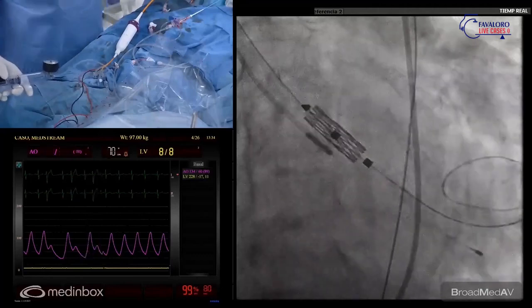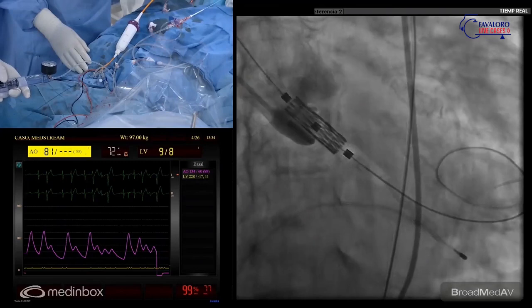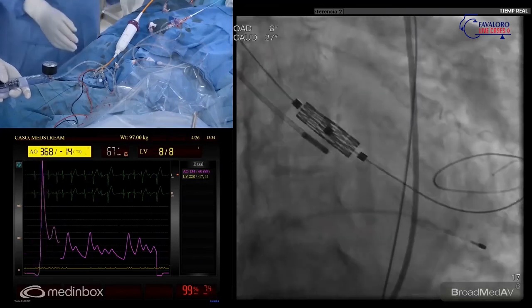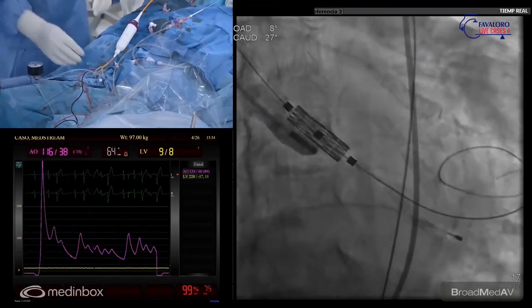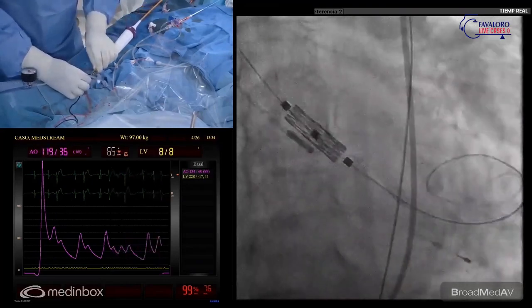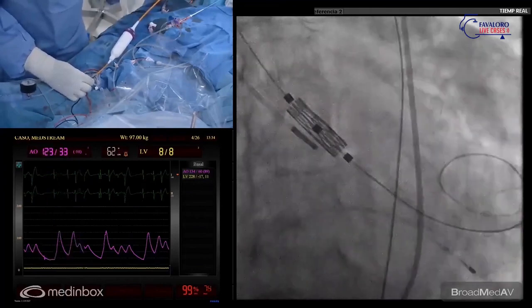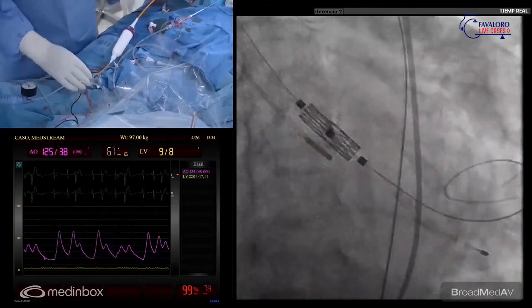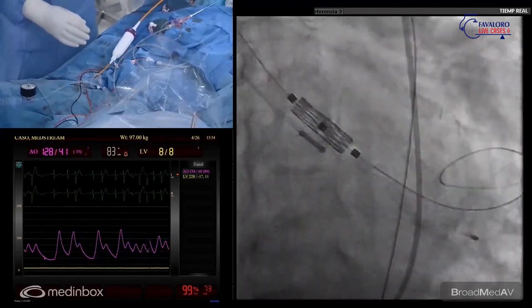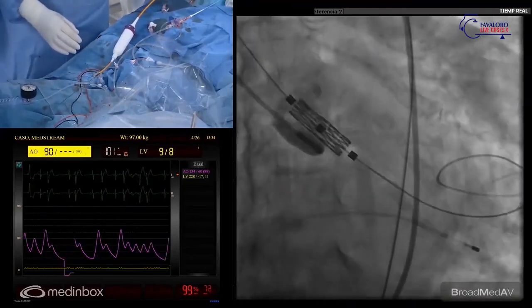Let's do an angio, I will show you. Angio. See. Yes, it is low. I would go like 1 millimeter above that. So you rather choose the wide band. Exactly. Probably there. Okay, good. Let's check.